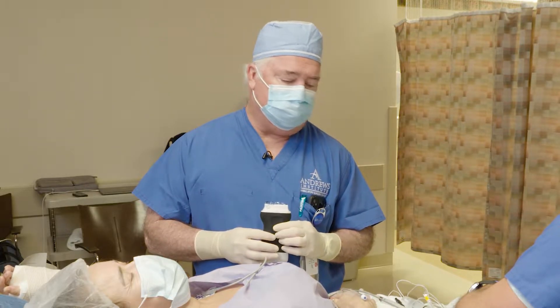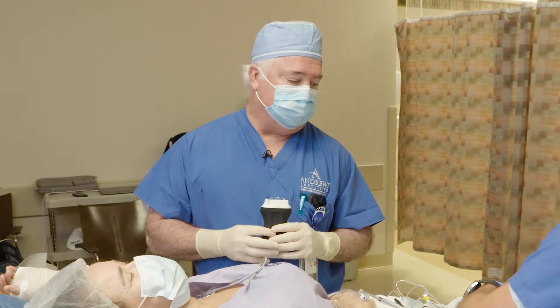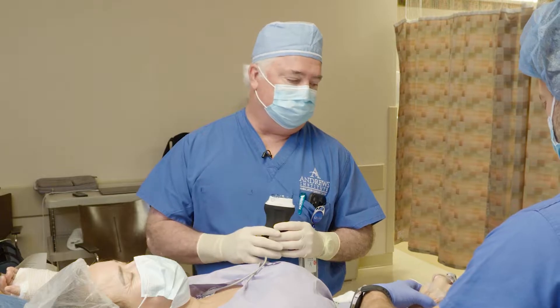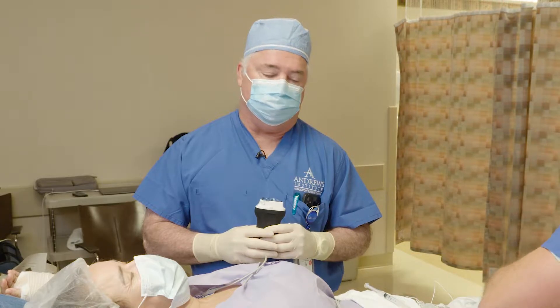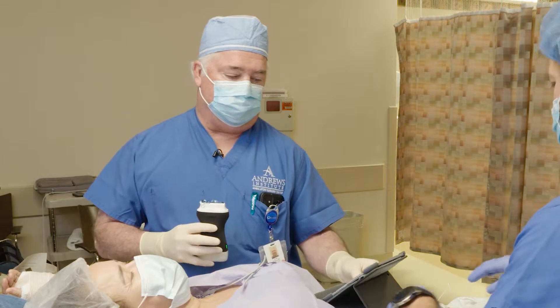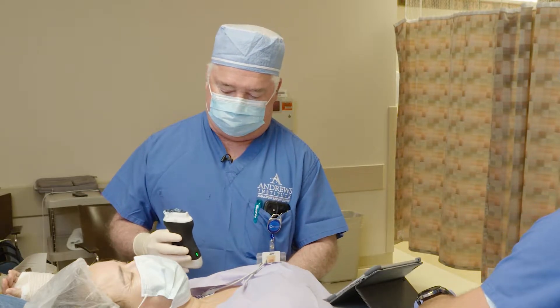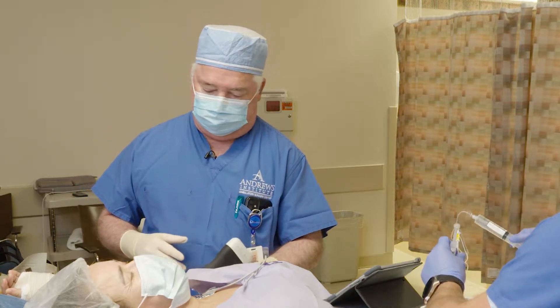I just have to be really careful with the veins — there are a lot of veins in this area. There are a couple of ways to do it. We like to go find all the nerves, stimulate them with the nerve stimulator, and then inject a little local around each one. The other way is to just surround the axillary artery with local anesthetic, and that should get all those nerves for you. But we're going to stimulate — we always stimulate here. We feel that's just an added benefit to our ultrasound. We'll get started and see what it looks like.